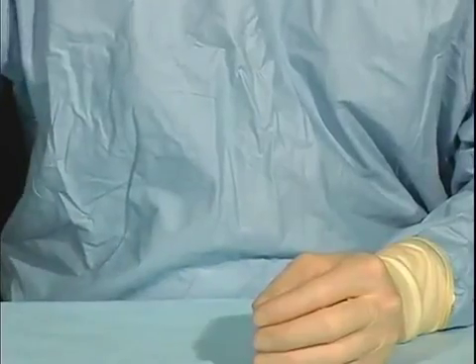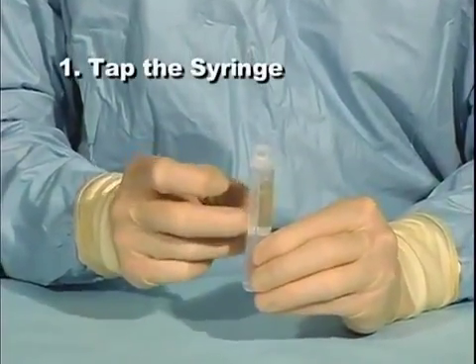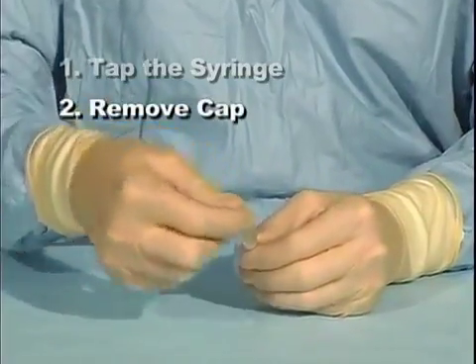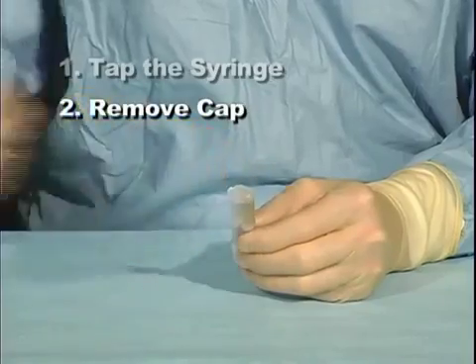In review, to assemble the BioGlue syringe, tap the syringe until the bubbles rise to the top of the solutions. Remove the cap by rotating the collar and gently lifting the cap from the syringe.